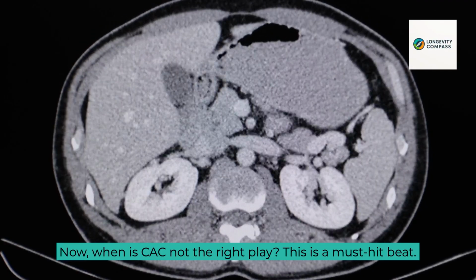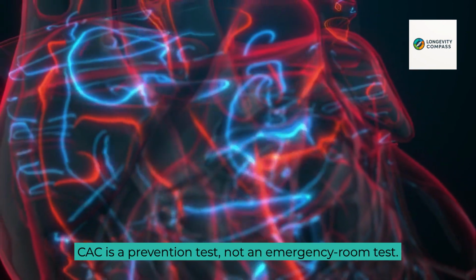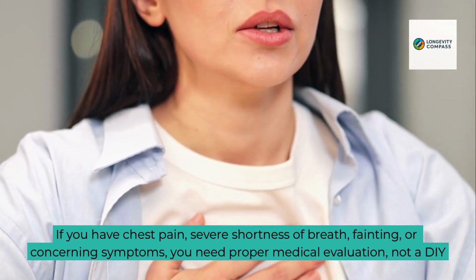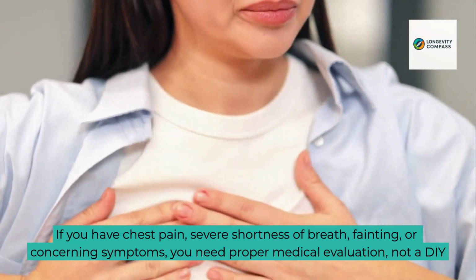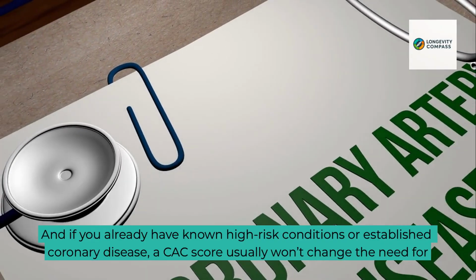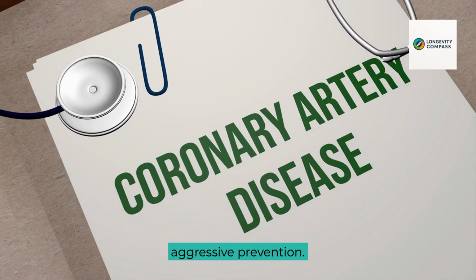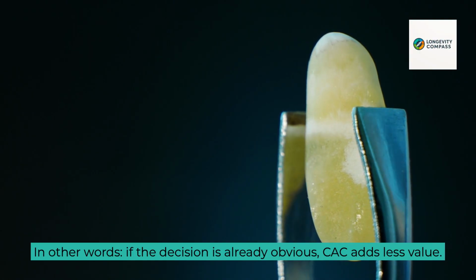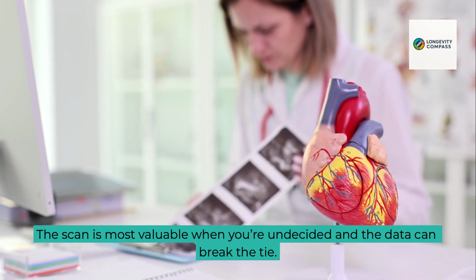Now, when is CAC not the right play? This is a must-hit beat. CAC is a prevention test, not an emergency room test. If you have chest pain, severe shortness of breath, fainting, or concerning symptoms, you need proper medical evaluation, not a DIY calcium scan. And if you already have known high-risk conditions or established coronary disease, a CAC score usually won't change the need for aggressive prevention. In other words, if the decision is already obvious, CAC adds less value. The scan is most valuable when you're undecided and the data can break the tie.